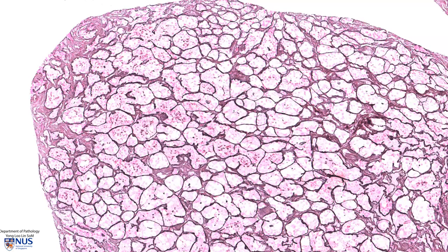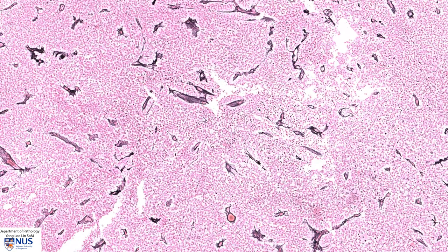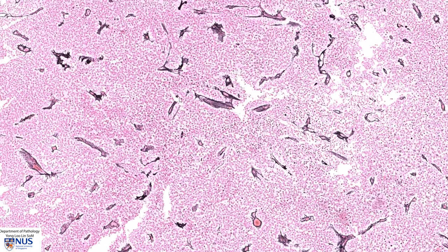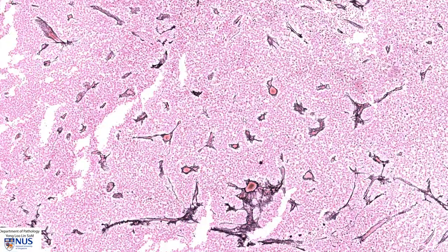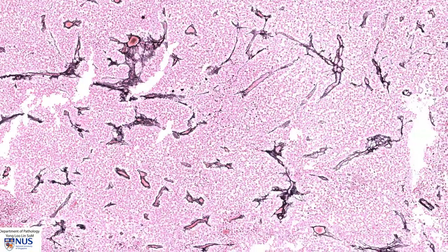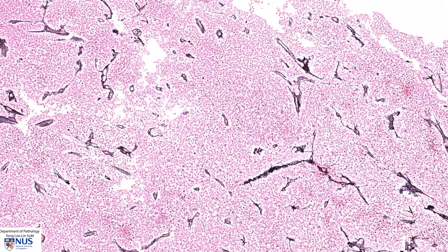Now let's contrast this with the pituitary neuroendocrine tumor that we just saw. Here is the reticulin stain for the pituitary neuroendocrine tumor. We can see that we have completely lost that beautiful compartmentalized pattern of reticulin staining — we only have some residual staining around blood vessels. As I move around, again we can see how that nice nested pattern is lost.